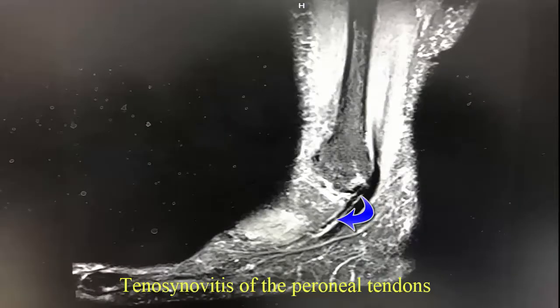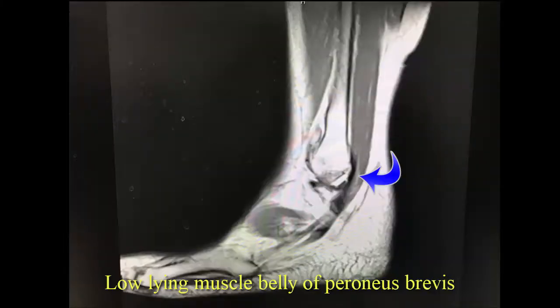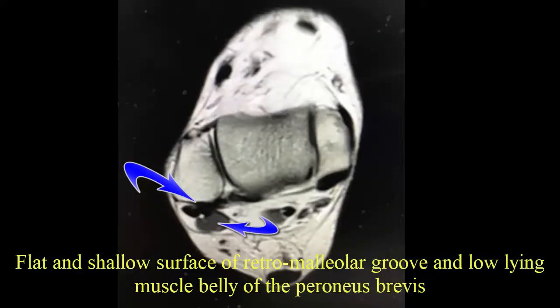This is the sagittal plane MRI T2 weighted image showing high signal intensity indicating peroneal tenosynovitis. This is the sagittal plane MRI showing low-lying peroneus brevis muscle over the retromalleolar area. Axial image showing shallow retromalleolar groove and low-lying peroneus brevis.